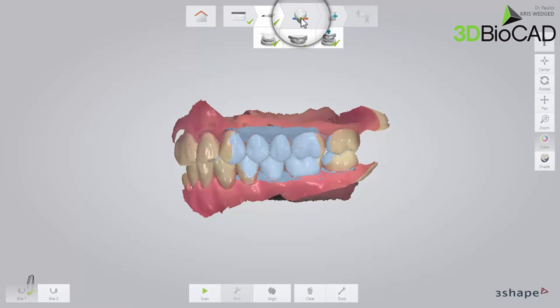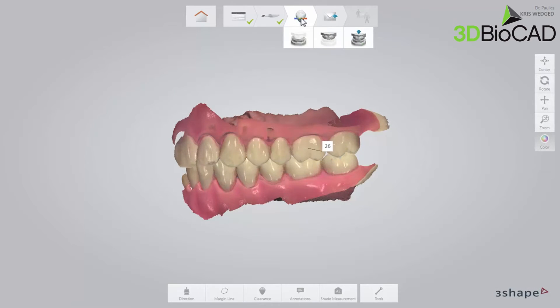Go to the validation page and confirm that there is enough space for the reconstruction between the upper and lower jaw using the clearance tool.